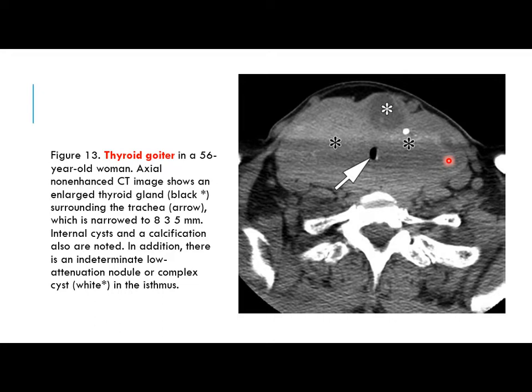Actually, the thyroid gland extension is usually a substernal extension, but sometimes its extension to the posterior mediastinum may occur. When we measure the retrosternal extension, we measure it from the suprasternal notch, from here downwards, how much it's extended.